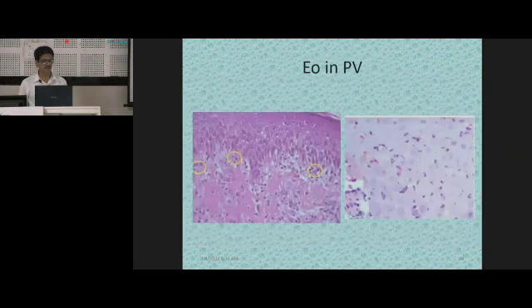One more clue that people have been looking for as to how to identify an early case of pemphigus vulgaris is attachment of the eosinophils to the desmosomal junctions away from the lesion. Away from the bulla, sometimes you find that there is some amount of collection of fluid, that is some spongiosis, seen over here, and then in this circle you can find an eosinophil attaching here. In this also you can see an eosinophil getting attached over here. That can sometimes be the clue.